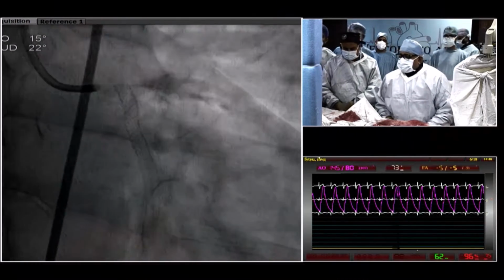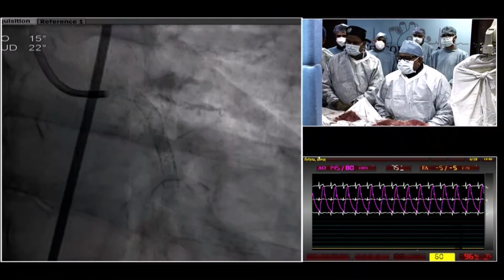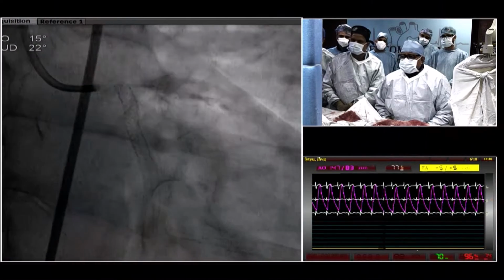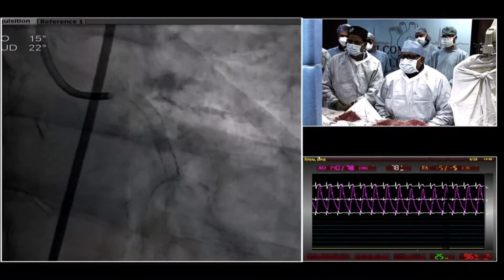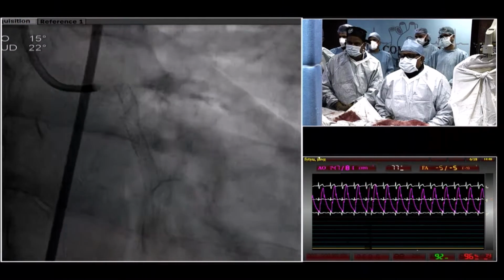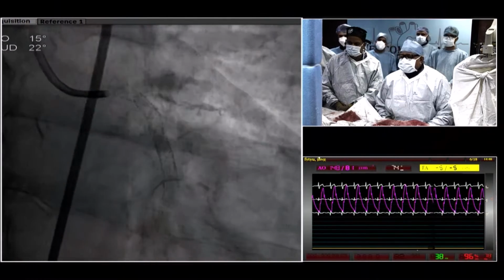First of all, it's a LAD, you can fluoroscope. Yes, please go ahead. So fluoroscope. What size guide can be taken? Because you'll be fighting with your wire and device in visible calcium. So guide is very important, support is important, wire is important, imaging is important. You should use the modern wires and gadgets and devices for plaque modification.